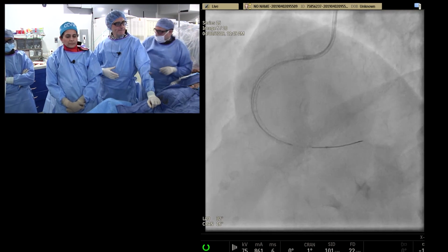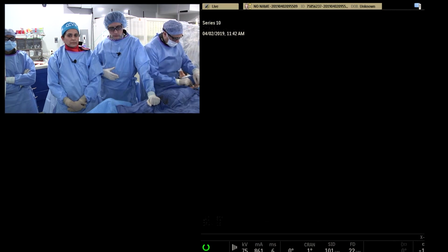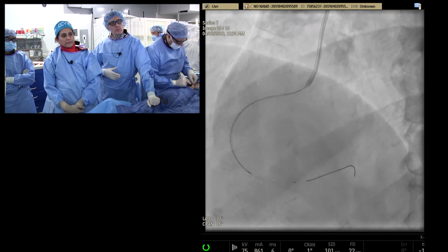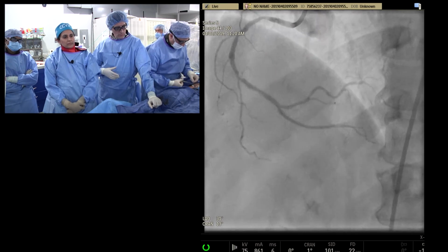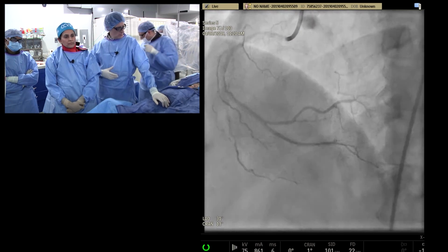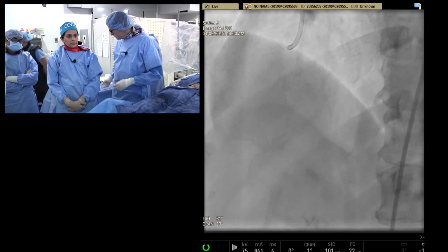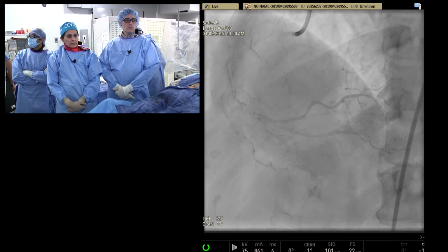As Dr. Dangus and Dr. Kinney alluded to, the first 30 days are the most vulnerable time. She does have a risk of stent thrombosis more than a patient who came for an elective PCI, because she presented with an acute coronary syndrome. It's important because we put a lot of stents, a lot of metal in this artery, in a small artery.